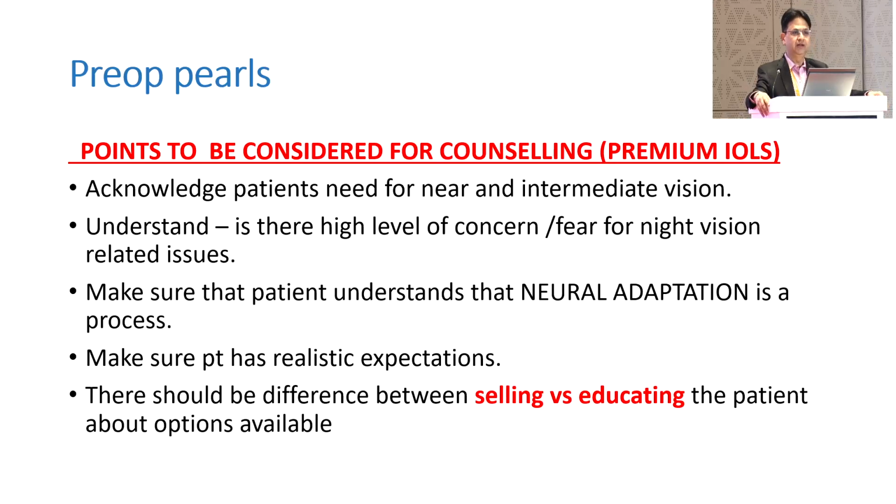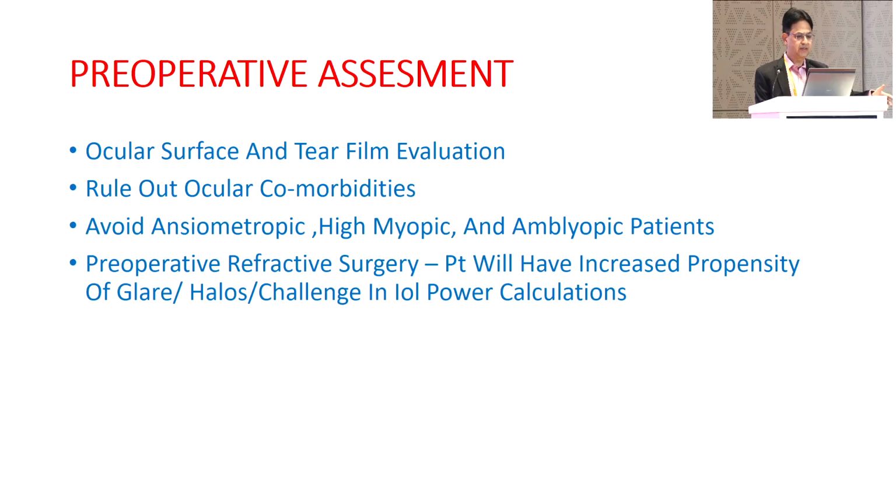We keep on saying this is the imported lens, the cost of the lens is so much, and this is the Alcon lens. Instead of that, we should educate the patient about the lenses: what EDOF is, what trifocals are, what monofocals are, what monovision is and everything. Now preoperative assessment will cover the ocular surface, TFT evaluation, and ruling out any ocular comorbidities.